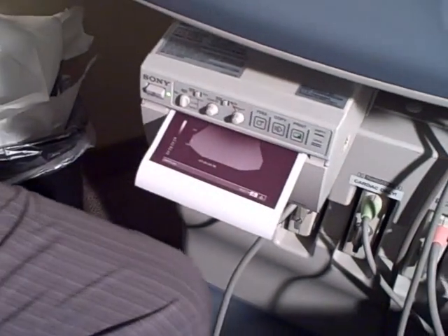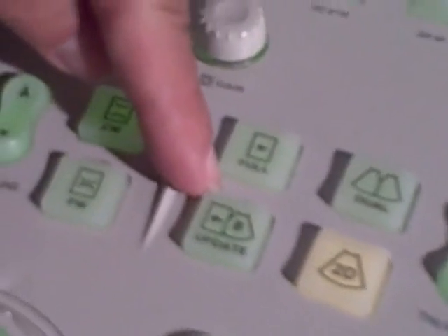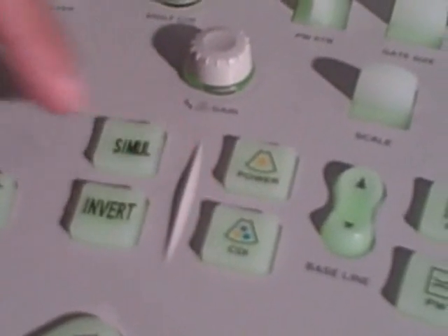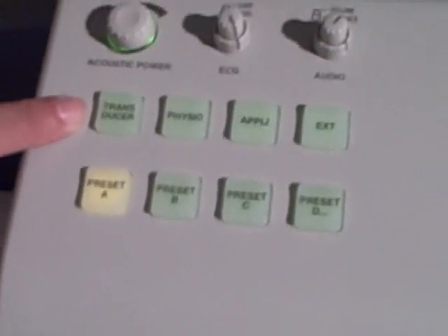We are going to make a review. Freeze, overall gain, print, text, set, next, B mode, M mode, spectral Doppler, color Doppler, calipers, time gain compensation, applications, and to change the transducers.